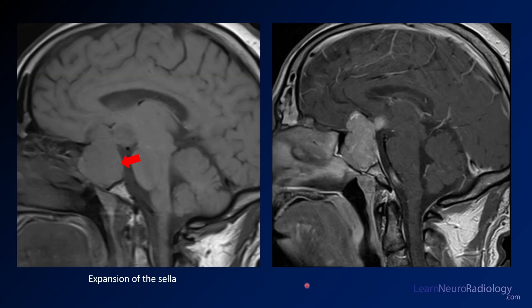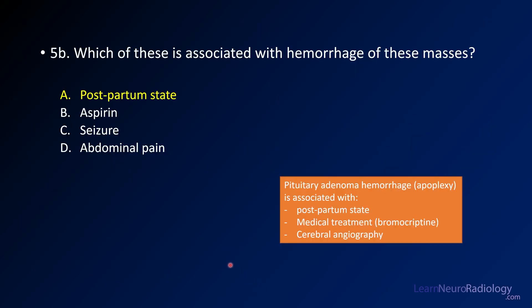On your sagittal images you see the same thing — expansion of the sella far larger than it should be. What you'll note is that there's still some normal cortex at the bottom, so this is expansion over a long period of time; you're probably not looking at a super aggressive mass. On your post-contrast sagittal you see suprasellar extension and a little nodule extending back. The optic chiasm runs right in between, which explains why this patient is having optic symptoms.